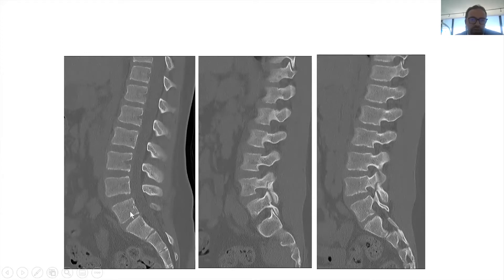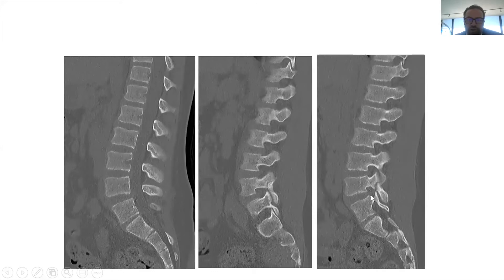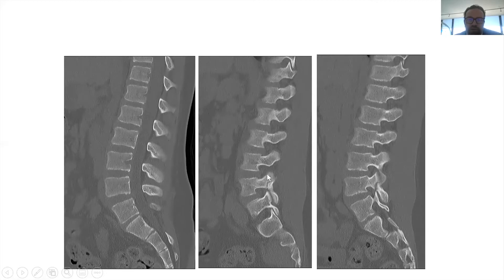This is the sagittal image — alignment is okay. These are the parasagittals and there's a fracture here — a fracture of what we call the pars interarticularis, which is the region of the spine that bridges the inferior facet to the superior facet. This is L4, so it's a pars fracture of L4.